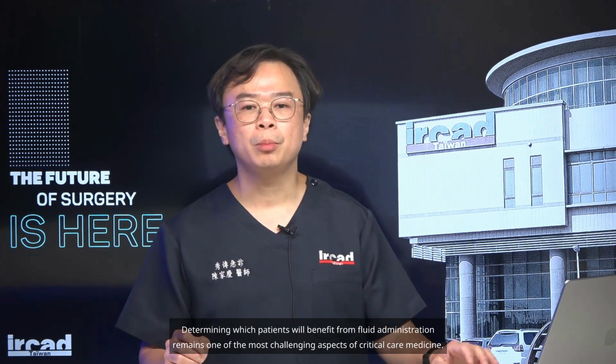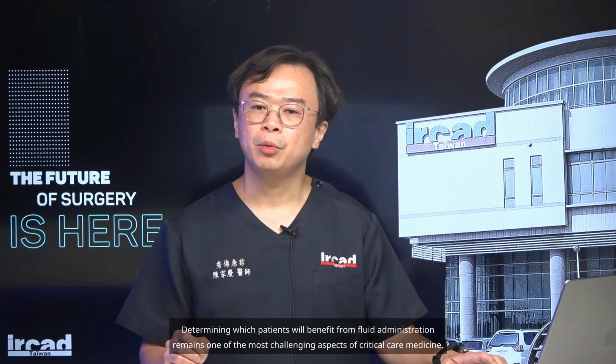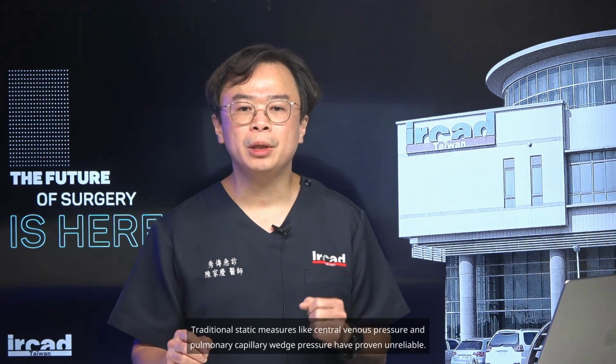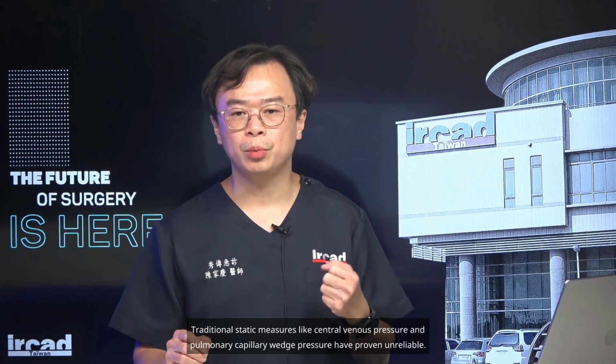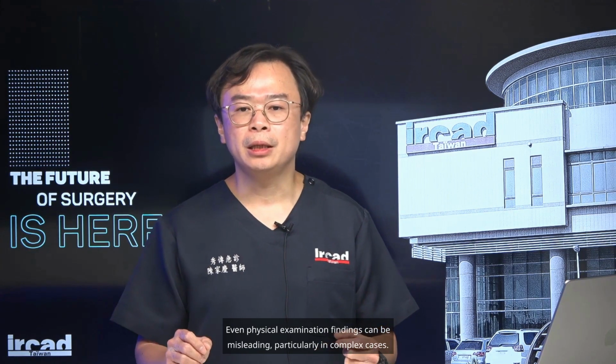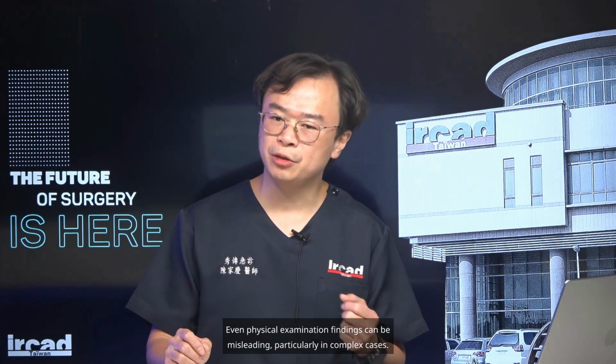Why use LVOT VTI for assessing fluid responsiveness? Determining which patients will benefit from fluid administration remains one of the most challenging aspects of critical care medicine. Traditional static measures like central venous pressure and pulmonary capillary wedge pressure have proven unreliable. Even physical examination findings can be misleading, particularly in complex cases.